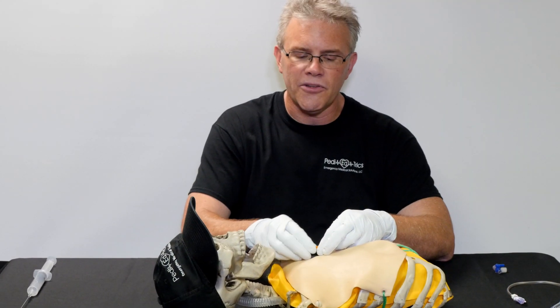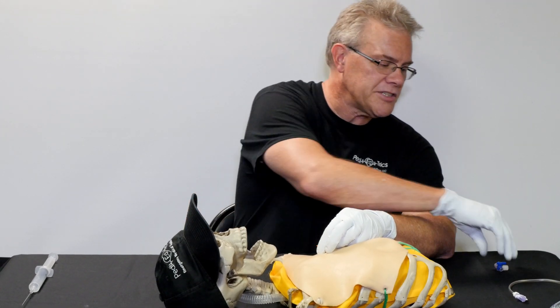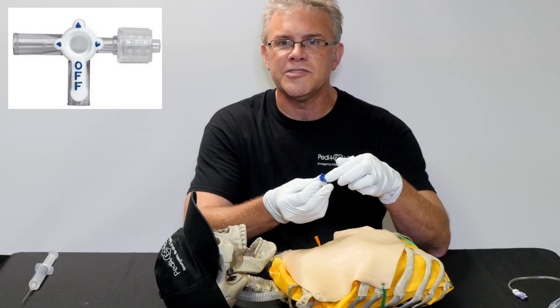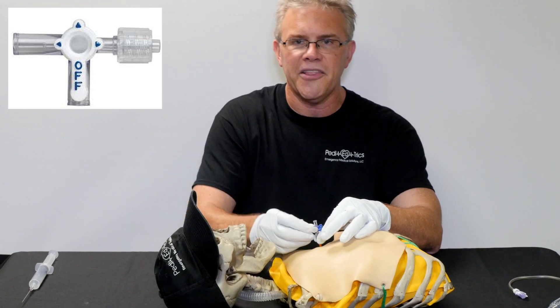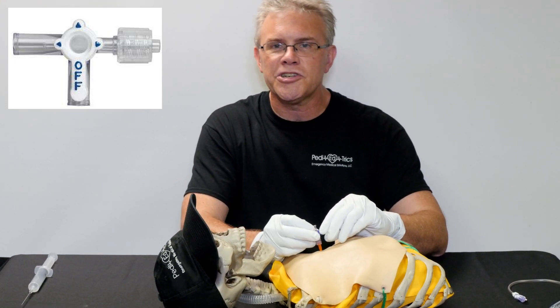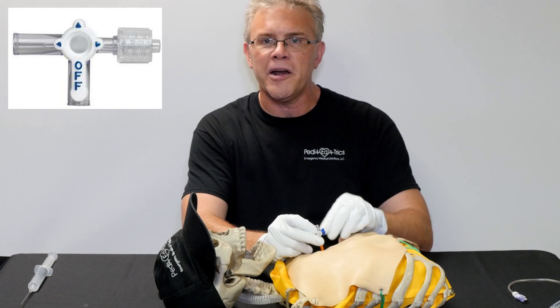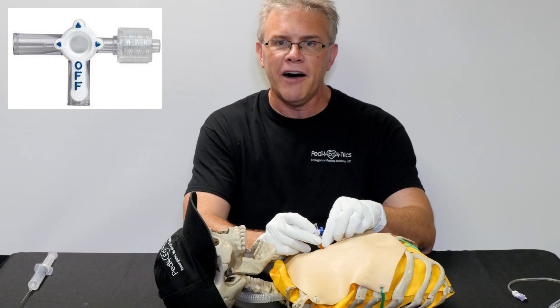Now the last part: the catheter is in the chest — what do you do with it? You've got a couple of options. First, if you have some variation of a stopcock — remember, if you read it off, it means off — it screws onto the catheter. Like in the movie Three Kings, George Clooney demonstrated turning it off to the patient, then opening it up so air could be released when they had difficulty breathing, and flipping it back off when they were better.